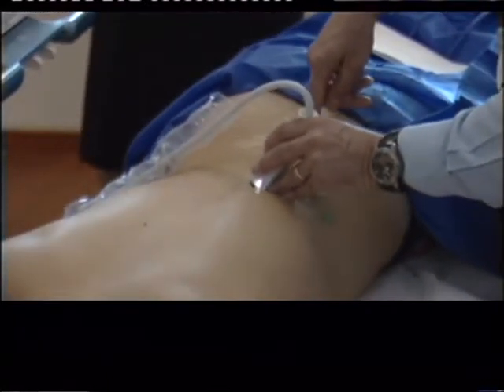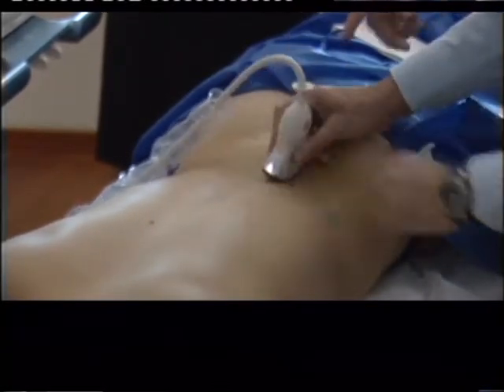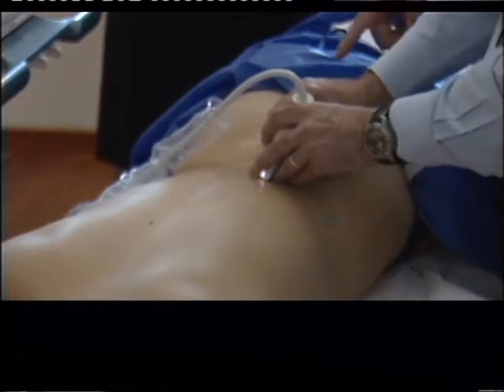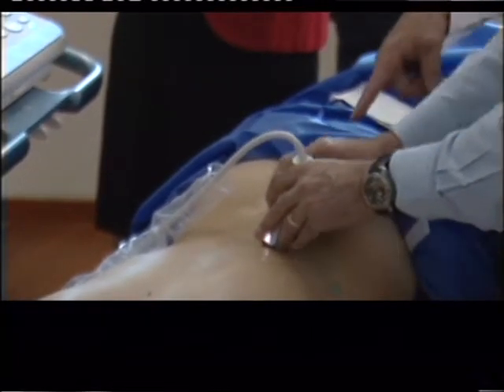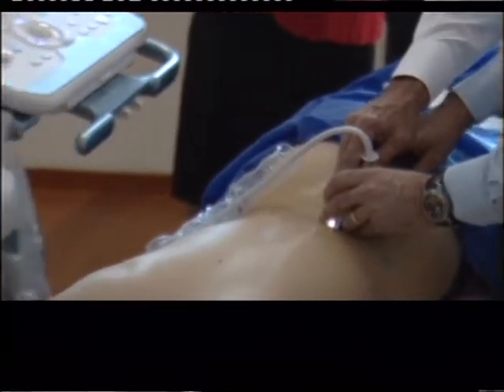You use this scan and the ingress of the needle here. And for facets, I go out of plane. Like, see, here's the facets right there. Then the angle of the needle, and I can do 1, 2, 3. So I go 5, 4, 3, and this is the interfacetal space, the articulation.